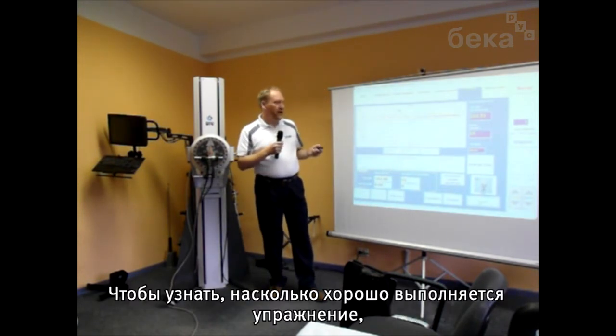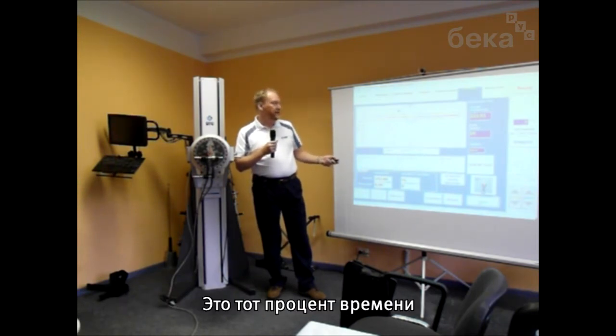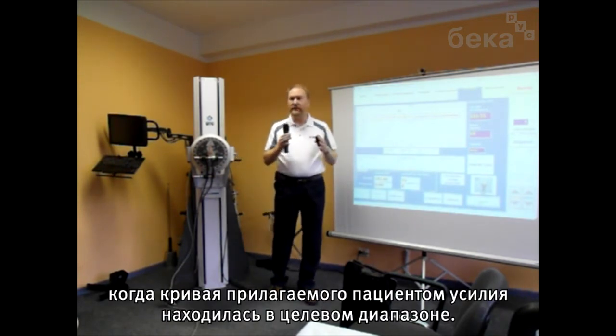The way this exercise is scored is, again, we look at the percent on target value. This is the percentage of the time that the person was able to maintain their force output in that prescribed range.